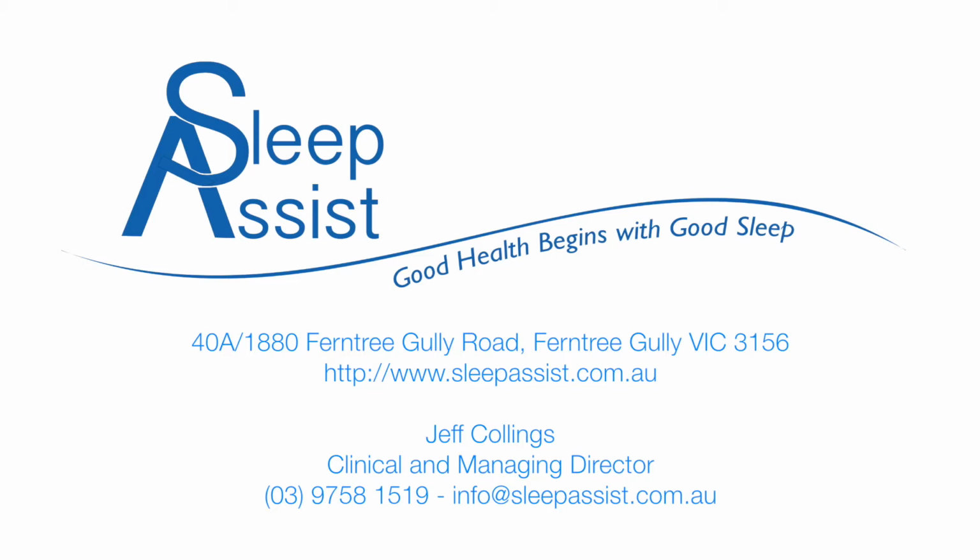your health. Once you've returned the PDX unit and relative equipment to Sleep Assist, your results will be analysed by a sleep scientist and reported on by a professor in sleep medicine. Sleep Assist will then call you when we have those results and a copy sent to your GP.